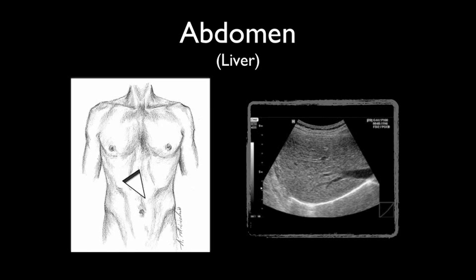With the liver in the center, the diaphragm appears as a hyperechoic structure that moves up and down. Also notice the IVC. By moving the probe 10 to 15 degrees, the liver's vascularity can be revealed. As one can see from this picture, the hepatic veins are emptying into the IVC.